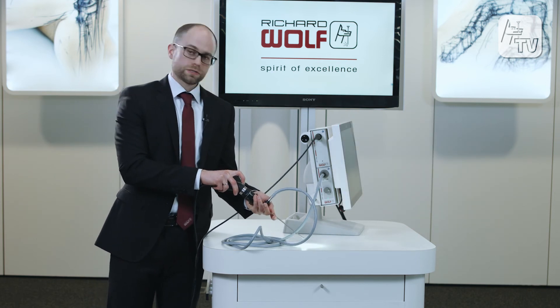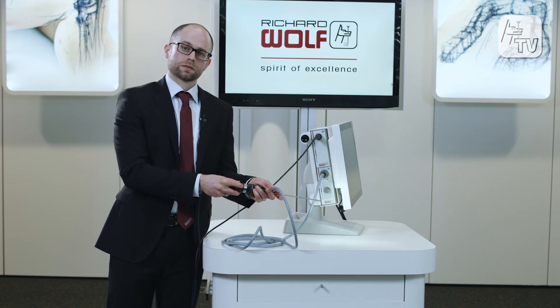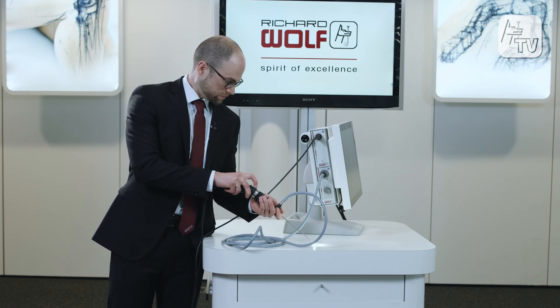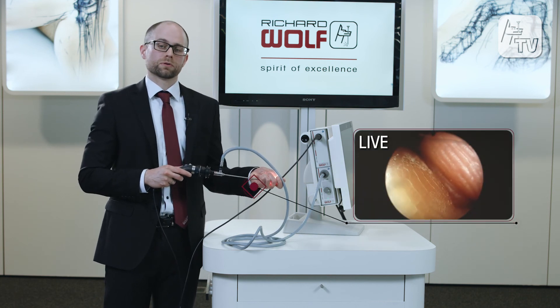The white balance of the scope is also easy to operate by simply pressing the first button on the camera head. Once I have it white balanced, I am now ready to perform the examination.